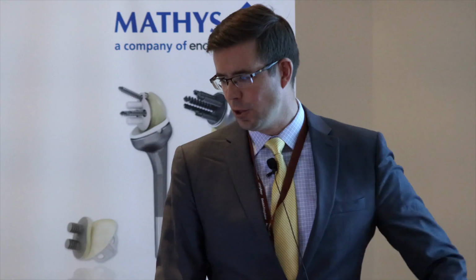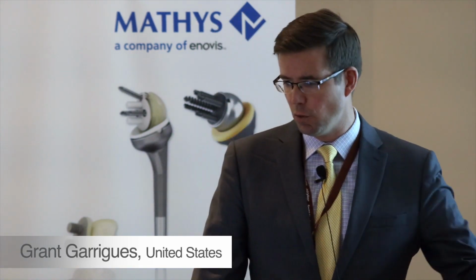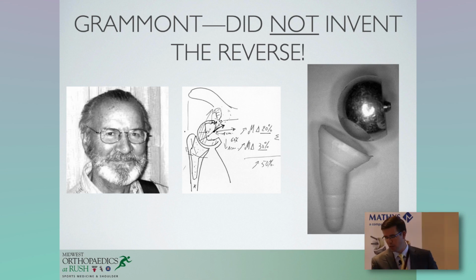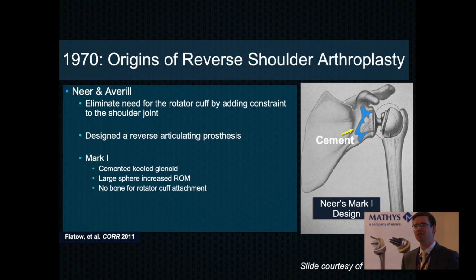Again, as I mentioned, we're going to summarize some of the stuff you just saw and then take it to the next level. So Paul Grammont, as you just heard, did not invent the reverse, right? We saw this slide with some of the early prostheses. So why did they have this lateralized design initially, even though these failed until Grammont came up with his genius innovation of medializing things?